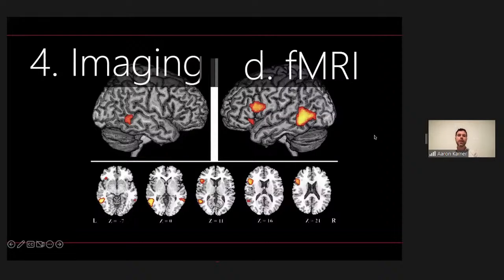The setting that I see fMRI used for most frequently is in assessing patients prior to their getting a surgery or another procedure. And the main reason for using fMRI in that setting is to determine where their language centers are, where their motor centers are, especially in the setting of tumor or another lesion that the surgeons may be going in and going after that could be close to high real estate areas of the brain.